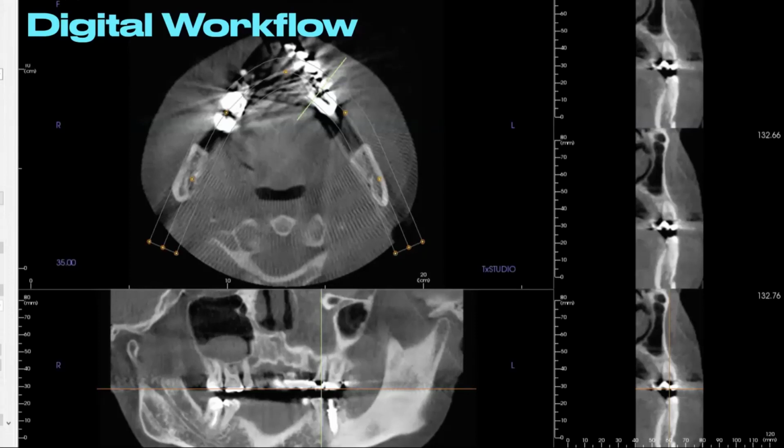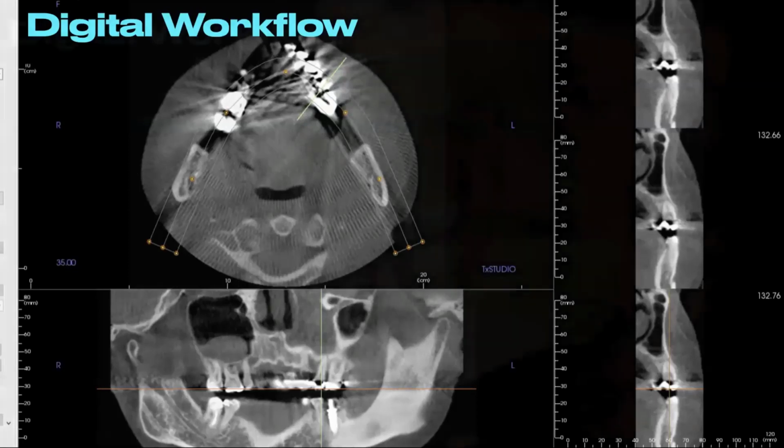And so then what we end up doing is looking at something and saying, oh gosh, there's an overhang, that must be the problem. Or gosh, who would do it that way? And then we start throwing each other under the bus. But in general, what we need to do is document things properly so we can see what's changed. That's very important in the use of radiology, but also super important when it comes to surgical intervention and making sure that we double and triple check our work when we're doing surgery.